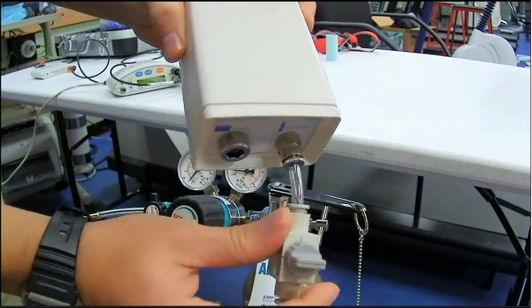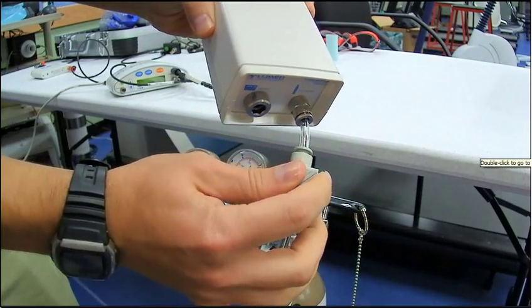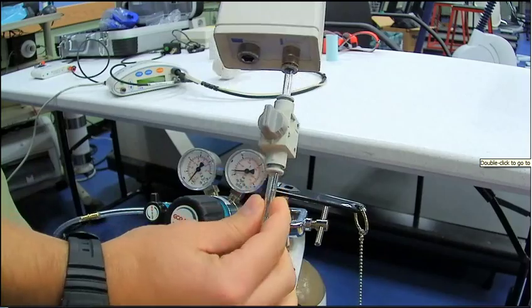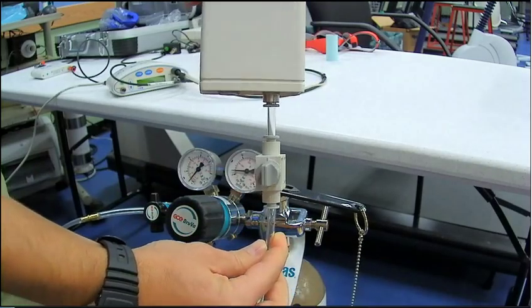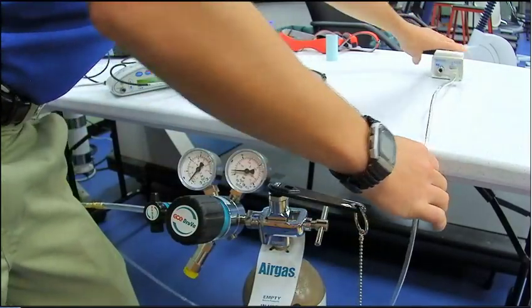You're going to grab the gas calibration box, and you're going to open this knob so that it's parallel with the tube, which means it's open. It's going to allow air to flow into the box.